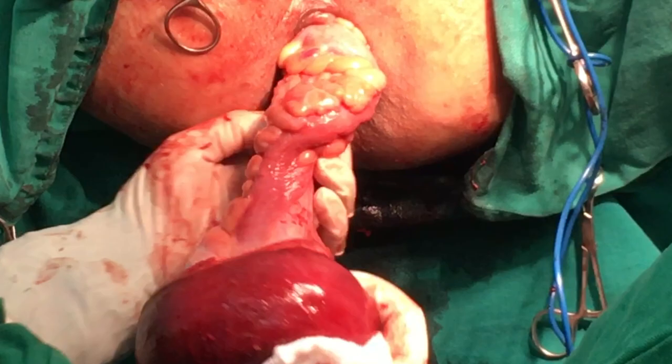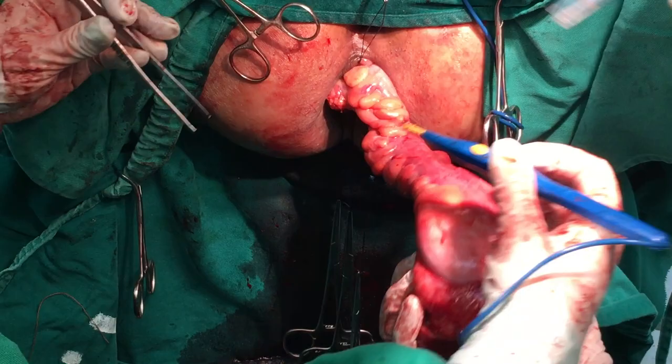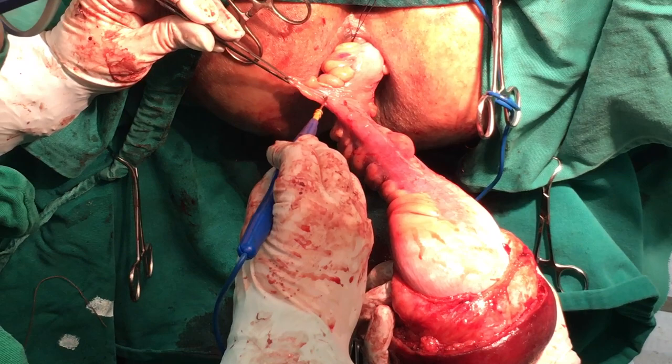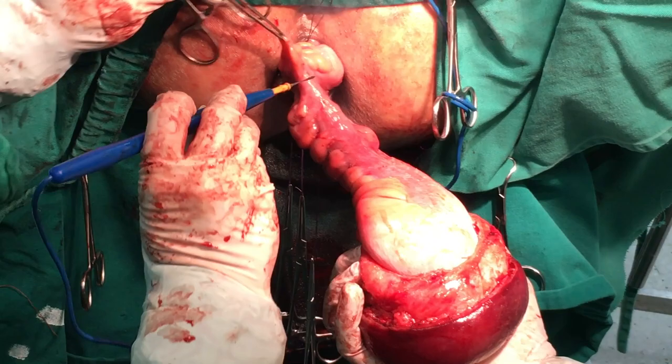The prolapsed incarcerated rectum is resected up to the viable portion. The distal edematized rectum is resected before initiating the circumferential anastomosis to prevent avulsion or perforation of the proximal colon.